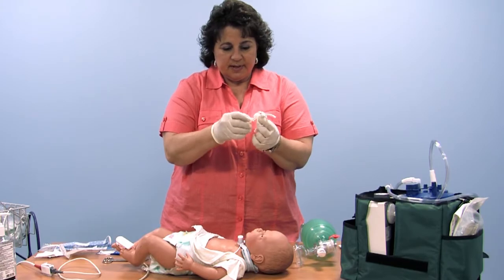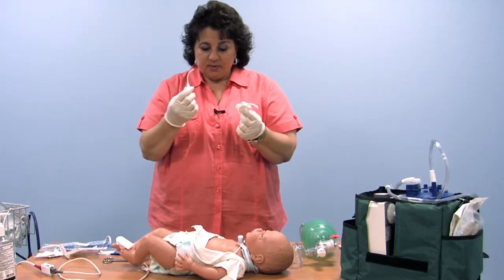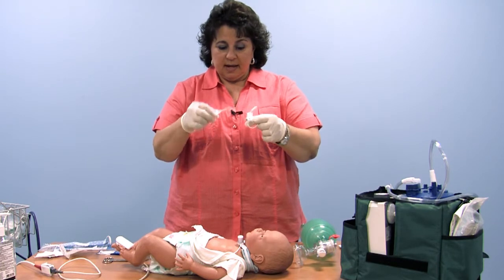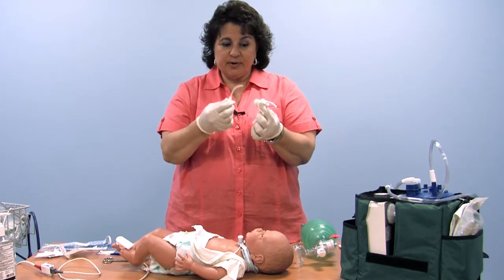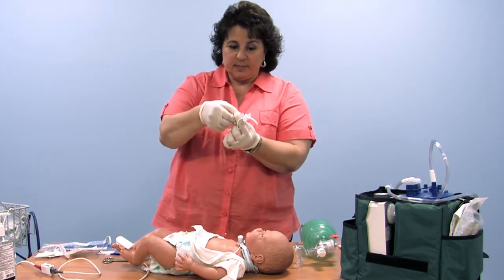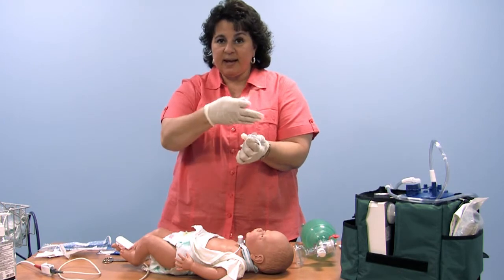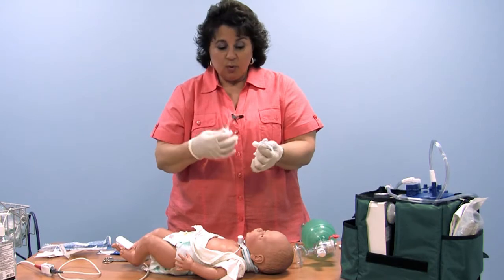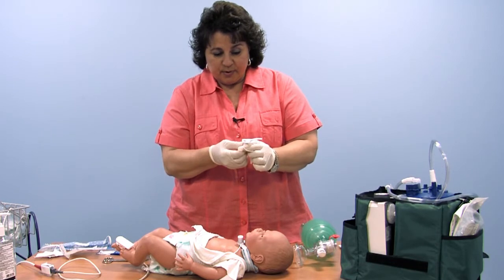This other little piece of plastic here is called an obturator. You'll see that the tracheostomy tube is very flexible, and if I try to insert it, it might bend and crinkle up upon itself. So this obturator is provided to keep the tube firm during placement. Once this is placed in the child, it should be immediately removed so the child can pass air through the tracheostomy tube and be placed either back on their ventilator or on oxygen or mist, whatever they were breathing prior to the change. So we'll put the obturator back in.